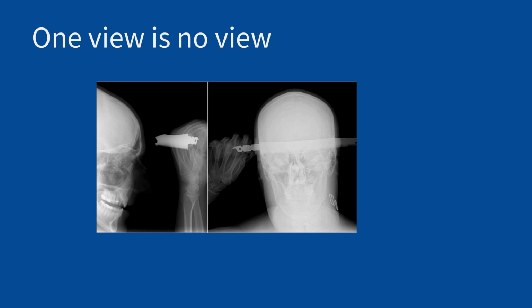So overlapping objects, you really are not able to distinguish if you are looking at it from one perspective. The challenge is that people kind of get a sense that they can, but you are really collapsing a 3D object into a 2D surface. So there is simply no good way to distinguish overlapping objects unless you have some kind of reference landmark.